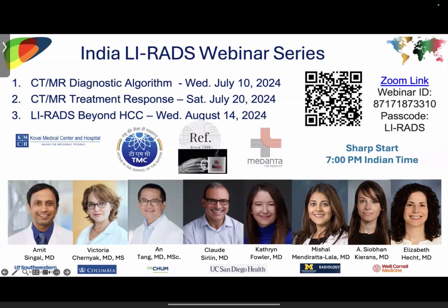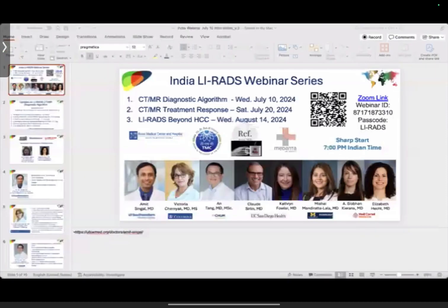In terms of suspecting it, I think that MR is especially helpful because we observe signal characteristics that are mild to moderately hyperintense on T2, similar to the spleen, which helps us detect this infiltrative disease. Another helpful feature is that it's often associated with the presence of tumor in vein. That's how I would approach infiltrative disease. Great. Thank you.